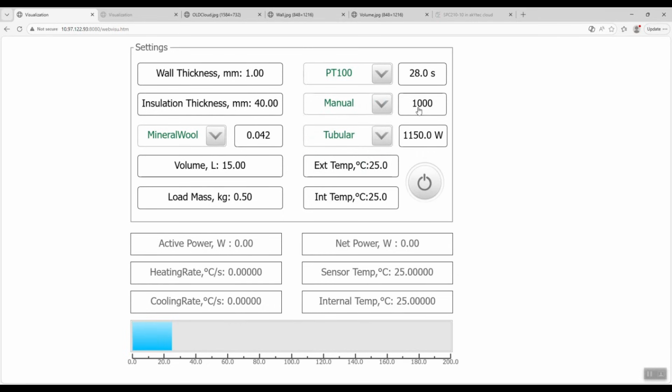For manual mode, we can set the maximum number of positions for controlling the heater power. If you set 1 for manual mode, this will correspond to 2-position heater control, where 0 means 0 power, the heater is off, and 1 means maximum heater power. The heater is on. The 8th parameter is the heater type.